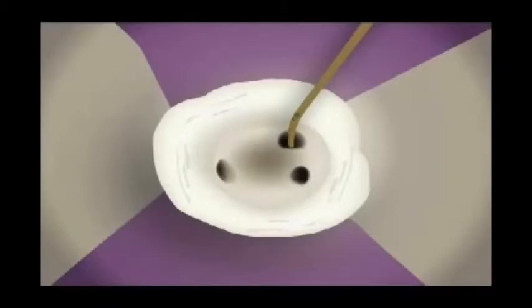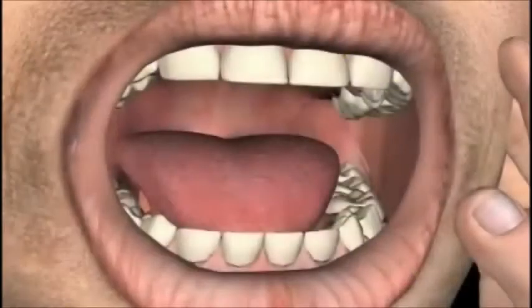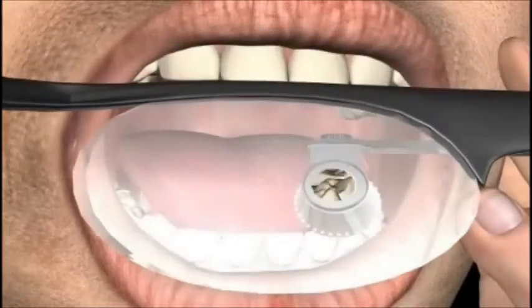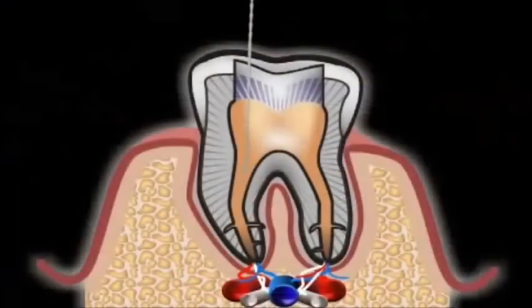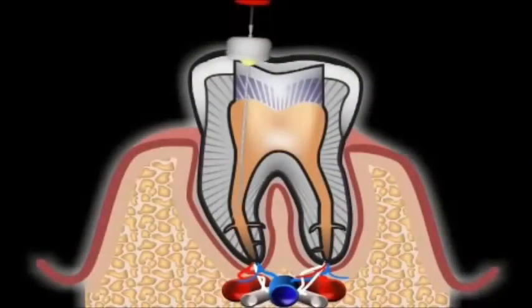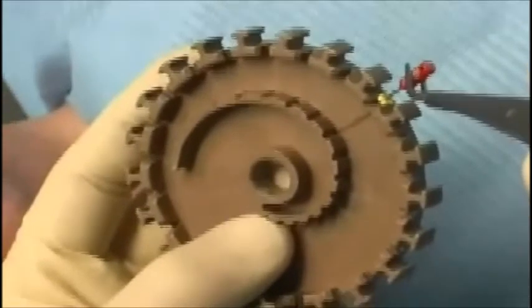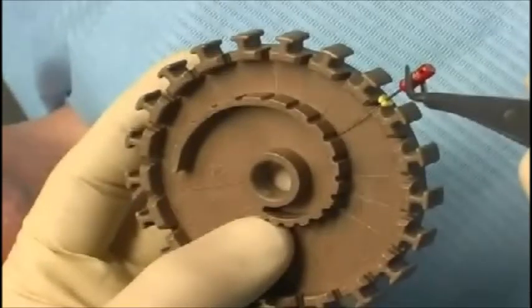Therefore, a precise and cautious dentist always works with magnification, such as medical magnifying glasses or even a microscope. The dental canal must be fully reconditioned all the way to the root end. The length of the root is ascertained by means of X-rays and measuring aids, as can be seen in this image. Only a well-reconditioned tooth, filled all the way down to the root end, can be preserved permanently.